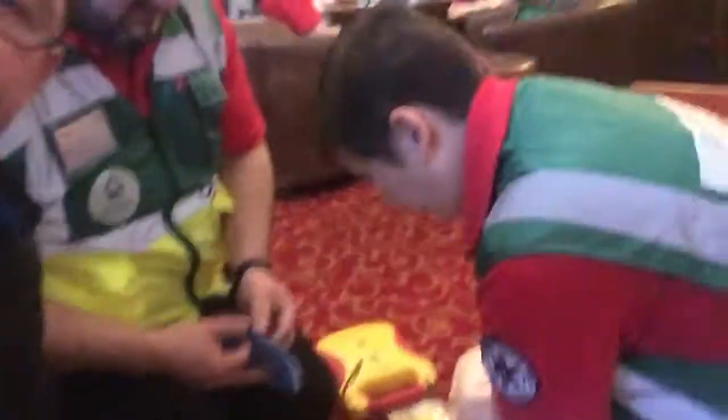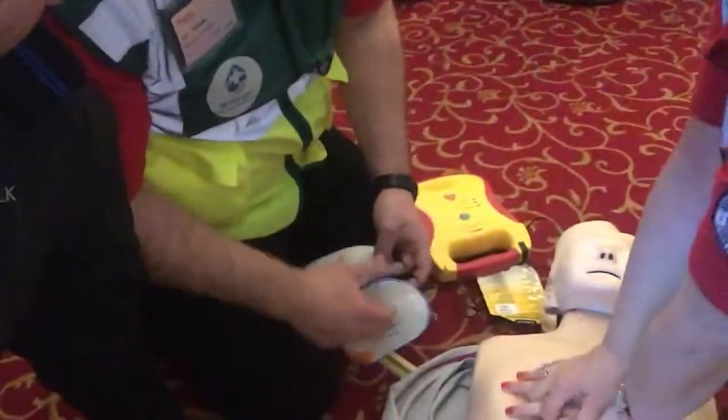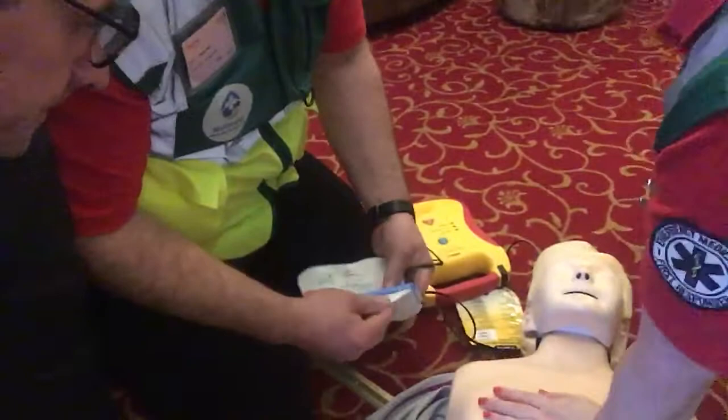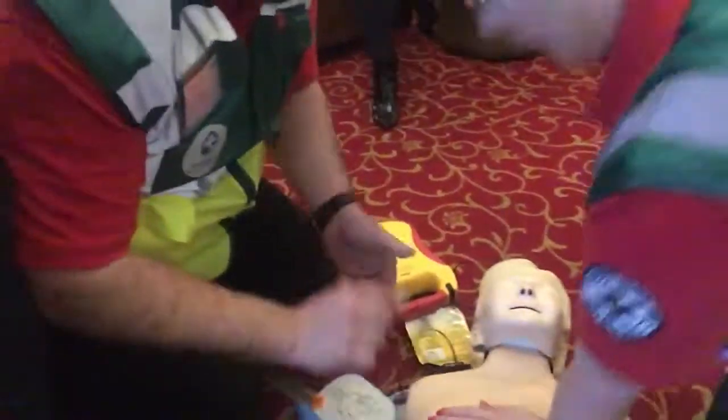Somebody's going to arrive with the AED — the AED has arrived, thank you. And then — what's your name? Brida — thanks Brida. Brida takes over the compressions. The important part is we're keeping the compressions going — that keeps the blood going through the body. Excellent, great job Brida.